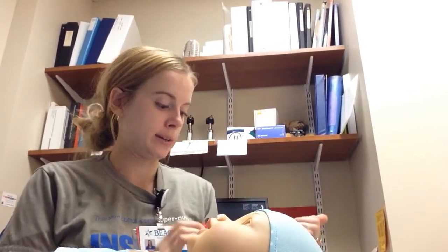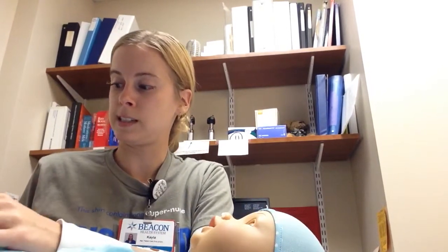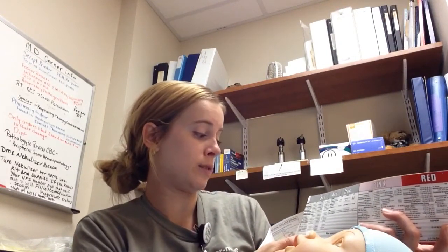And it is a color-coded, length-based tape measure. And the idea is when the kid comes in, your kid's going to be lying here. You're going to measure here from the red down to the feet. Wherever the foot stops, that is the size or the weight you're going to use. So here on this kid, it stopped at 4 kilograms. Here, then, it's going to give you all the information for seizure medications, hypoglycemia, overdose. It gives you ET tube insertion length, all based on this weight that you got using the tape. And then also that's when the Braslow cart that is color coordinated with this. So every single length here is color coordinated. You have your red, pink, purple, yellow, and the Braslow cart will actually have those colors on it so that you can have easy access to the right size equipment.